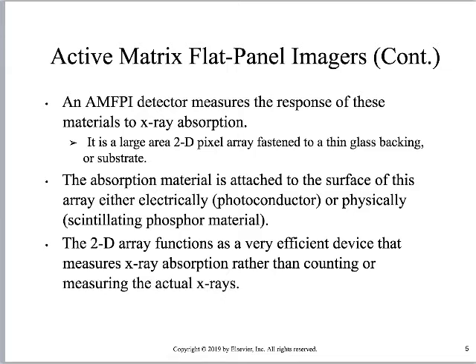So what is it? It is a 2D pixel array, right, fastened to a thin glass backing or substrate. Oftentimes when you see substrate and you're talking about computers, you can think silicon, but I don't want to confuse you, right? Both of these systems use silicon at some level for the substrate of the thin film transistors. That's how integrated circuits work, right? So I can show you demonstrations of like a breadboard or what that is. So the foundation is silicon, or glass, and we're going to build up integrated circuits on that foundation. So the foundation's the same, right? But I don't want that to confuse you, so it may be helpful just to think about it as a substrate.